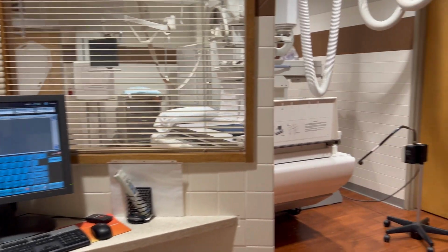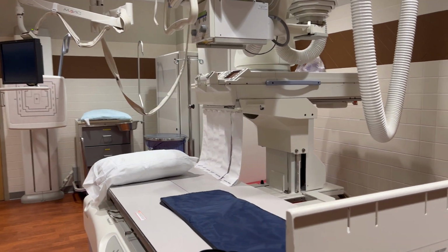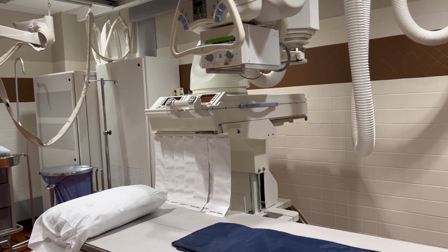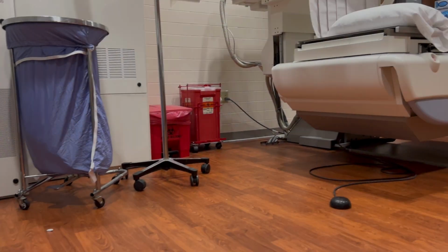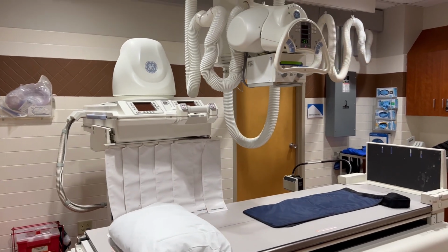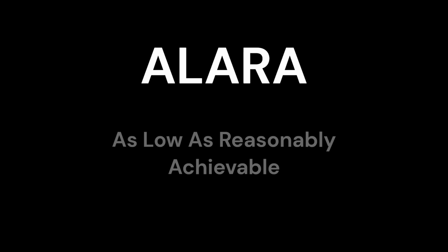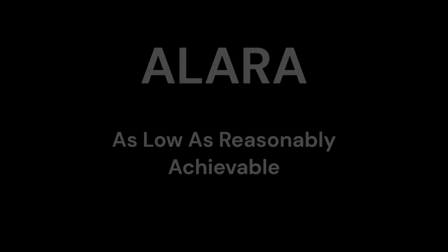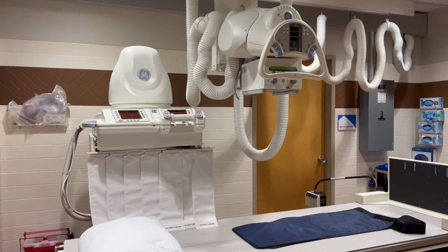In this video, we are going to highlight the main ALARA principles to follow when it comes to patient exposure. The three cardinal rules for implementing safe radiation protection include time, distance, and shielding, as well as proper collimation. X-rays use ionizing radiation and damage living systems, which is why it is important to use radiation safety guidelines, such as ALARA. Throughout the video, we will show the do's and don'ts of proper radiation protection to keep both the patient and the technologist safe.